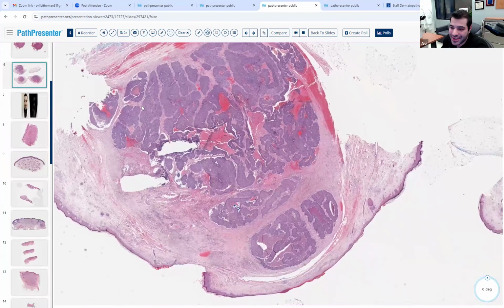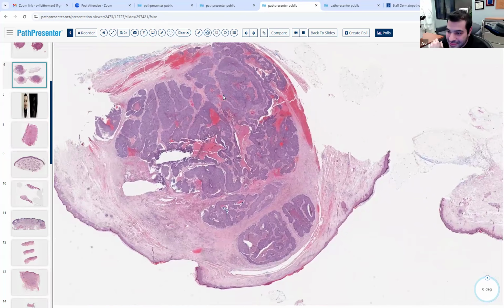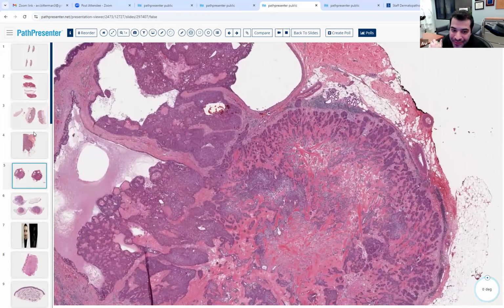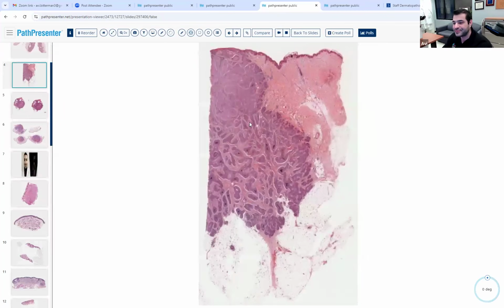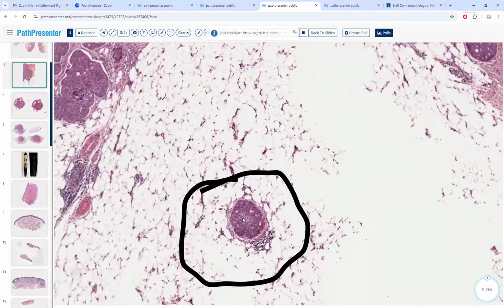So with the necrosis en masse, architectural complexity, and mitoses all over the place, this is good for what? Hidradenocarcinoma, as opposed to its more benign variant, hidradenoma. One other thing. What do you guys think about this one? It looks more infiltrative. Yeah. In fact, see that? Yes, down to the fat. Down to the fat.